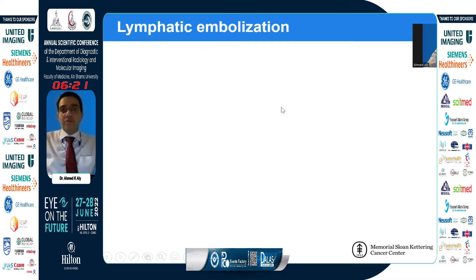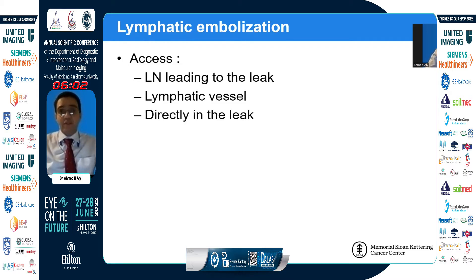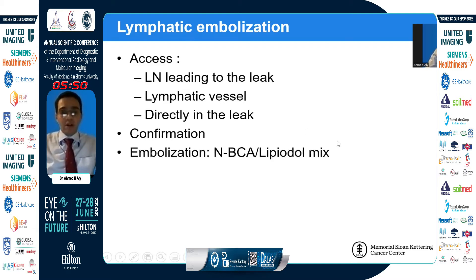Once we identify the area of leak, the next step is glue embolization. We use a 22 gauge needle and access either the lymph node leading directly into the leak, or a lymphatic vessel leading into the leak if it's large enough. If all else fails, we can directly access the area of leak and inject glue there — the local inflammatory reaction can sometimes seal the leak. Once in the vessel or lymph node, we confirm location and embolize using a combination of glue and lipiodol.